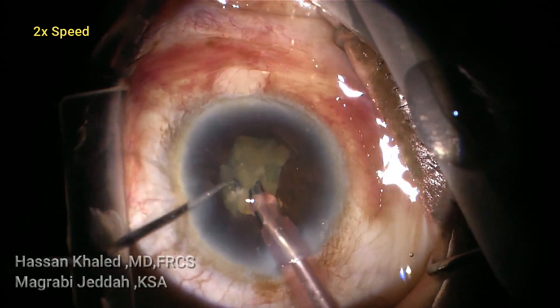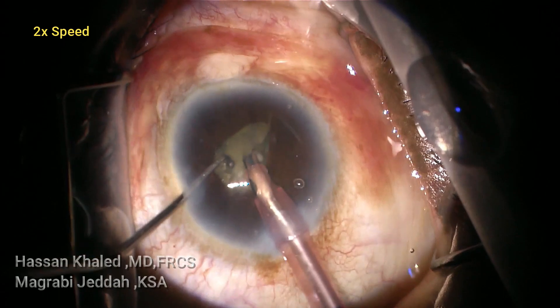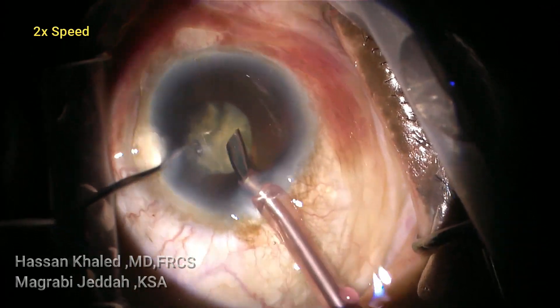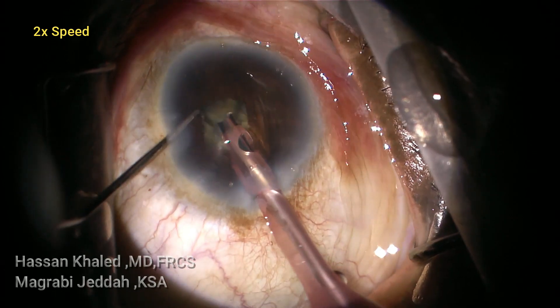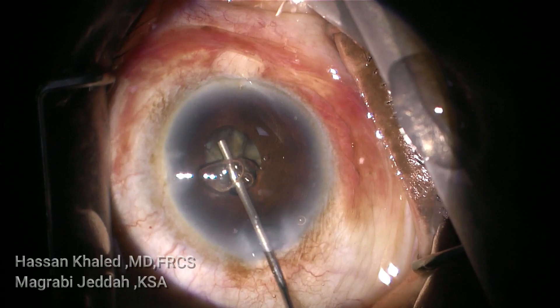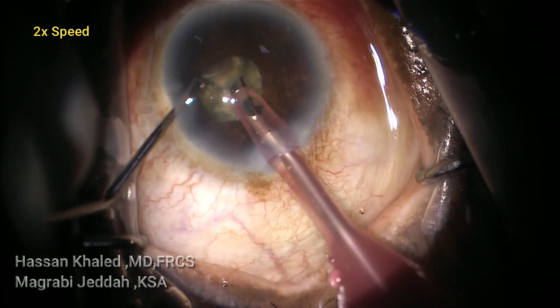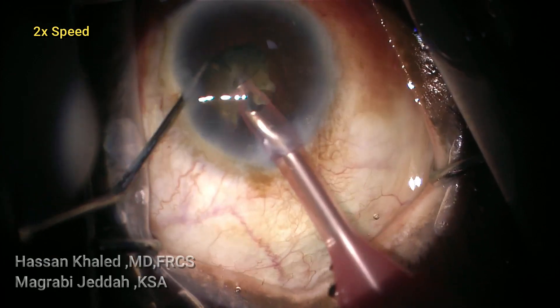At this point I damaged the pupil edge with the phaco tip. You can see the pupil is 2 millimeters. Again injecting OVD to complete this hard maneuver. Now the pupil is 1.5 millimeters — it was very difficult to emulsify this cataract through this small pupil. Again injecting OVD and continuing this hard maneuver.